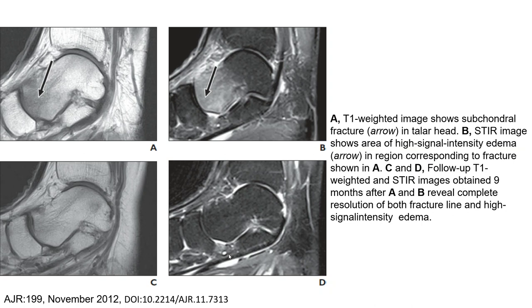Images C and D are follow-up T1-weighted and STIR images obtained after management following A and B, revealing complete resolution of both the fracture line and the high signal intensity bone marrow edema.